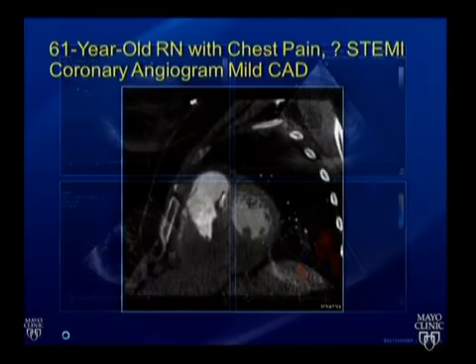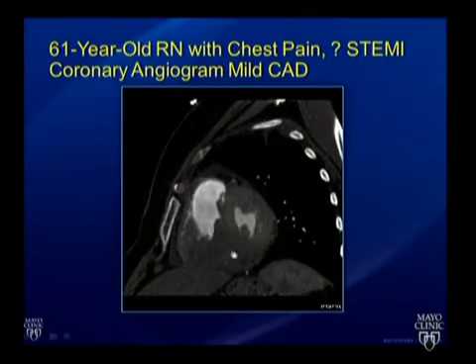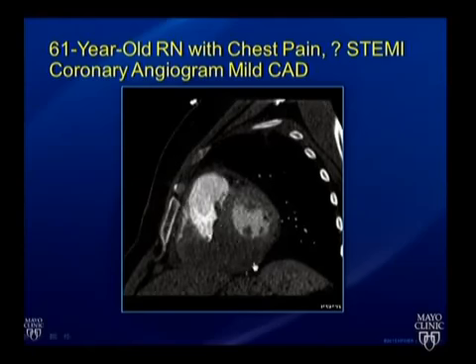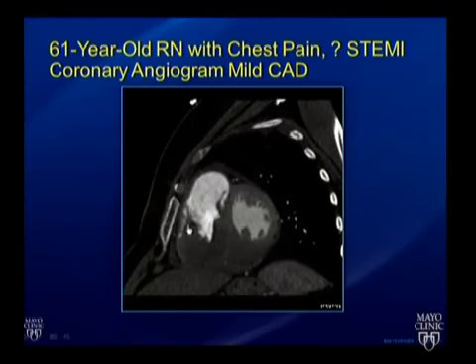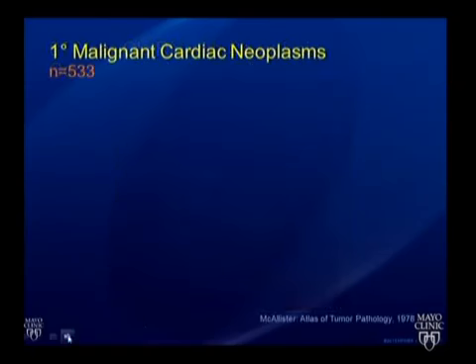It's standing still. When we do a CT scan, you can see that there's very much of a mass that's infiltrating the entire inferior wall, the right ventricle, the lateral wall, the inferior septum, the inferior wall of the left ventricle, and that, unfortunately for this lady, was metastatic breast cancer. And that's how she presented as a STEMI. She didn't know she had breast cancer.